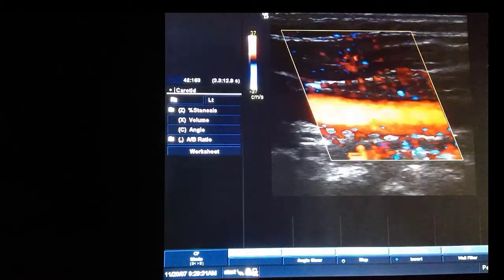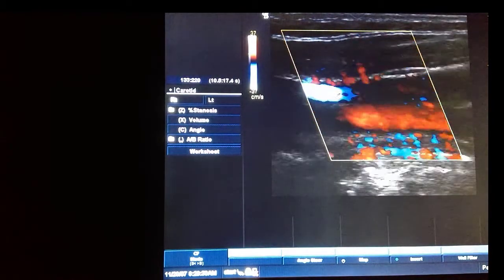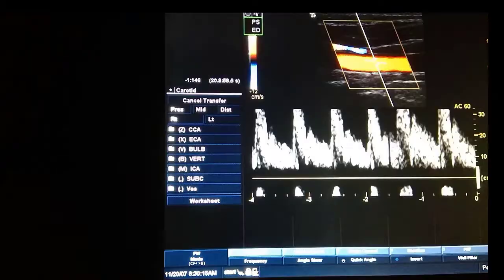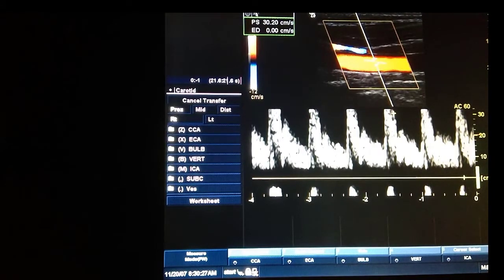And we actually have really nice blood flow right now. I'm going to reduce some stuff here. I'm not going to tell you what it is right now because we've got to fix it in a second. But I'm going to get some aliasing going on our screen. Alright, so there is a waveform that has aliasing. We can see our baseline here. We see the tops getting cut off. They're wrapping back around. And the actual peak of this waveform is actually right about here. So it's wrapping around, we're getting that aliasing.